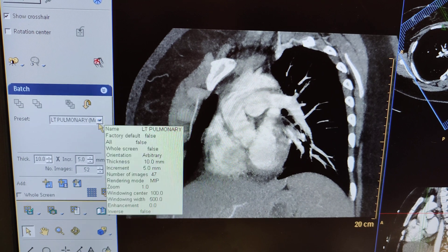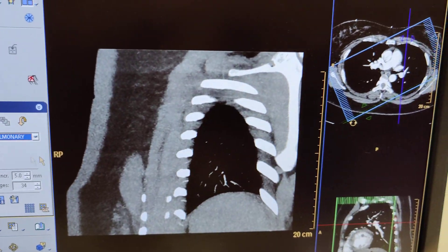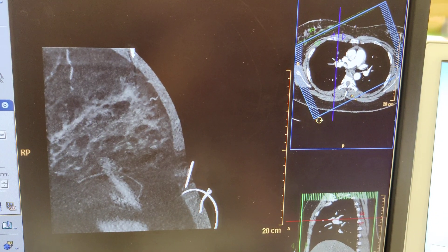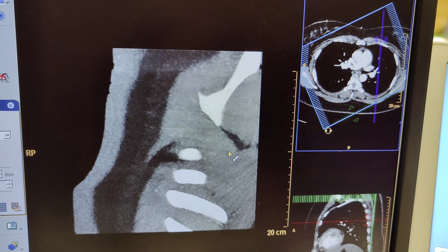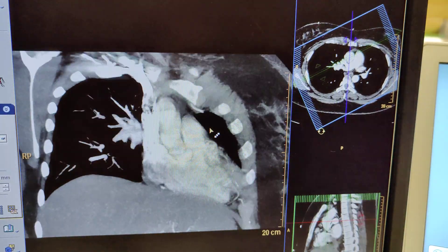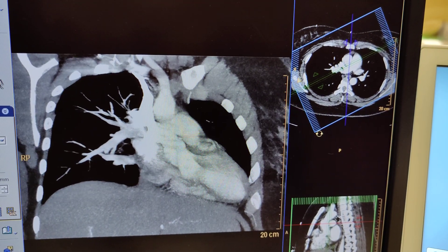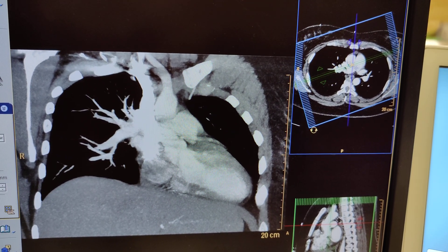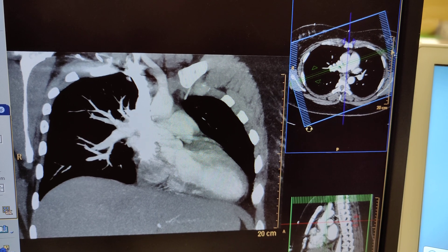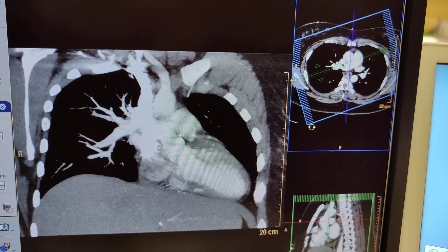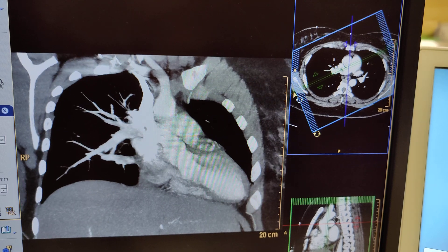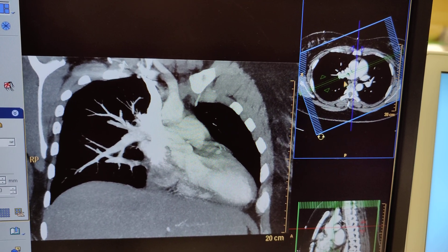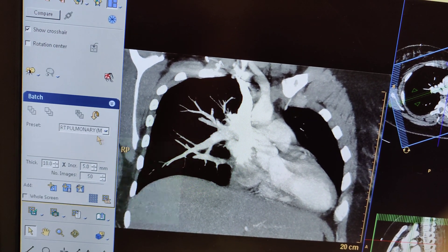Next is your right side. Open this and make sure you get all your lung filled. Left-click and scroll through it. You can see the green line here — you can also twist it. Make sure when you're twisting this that it's elongated as well. That looks nice and matches up — you've got all your lung filled.